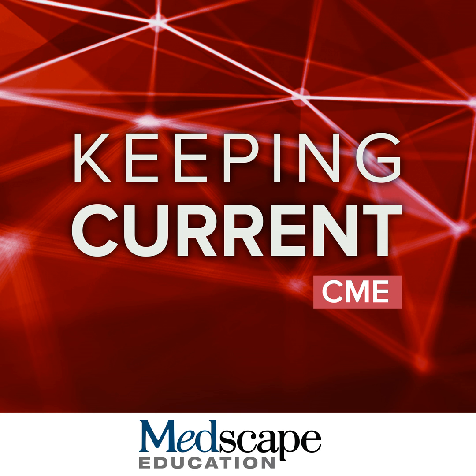So this brings us to the rapid CMR protocol. We now have techniques such as the rapid real-time cine imaging technique with compressed sensing, as well as the single shot motion corrected approach to really perform a simple cardiac MR protocol in less than 30 minutes, and in many respects, less than 10 to 15 minutes. Again, with these, you can inject the contrast early, right at the beginning of the acquisition to save time. You can add in some of these mapping approaches if you want to better characterize disease, but it really allows you to image the heart with a standard protocol in a very short period of time without any complexity associated with it. You can even add on stress perfusion to that rapid CMR protocol.